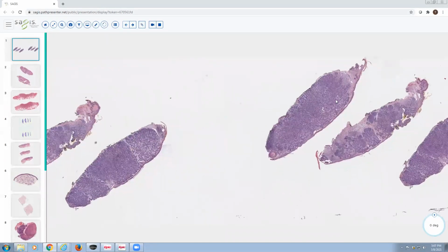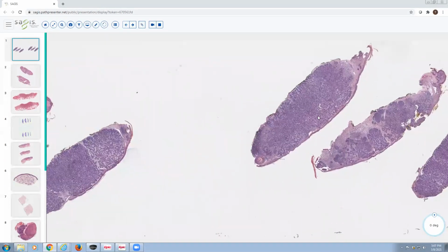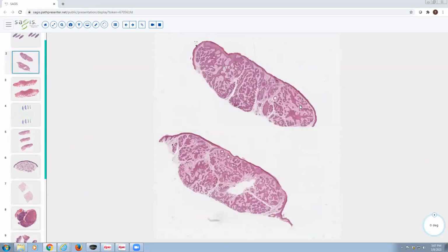purple. And that is a basaloid or a more primitive type of epithelial cell. The more basophilic, usually the more primitive the cell is. And as the cells differentiate, one of the processes a keratinocyte undergoes as it differentiates is keratinization. So once a cell starts making a little bit of keratin, the cytoplasm becomes more pink.